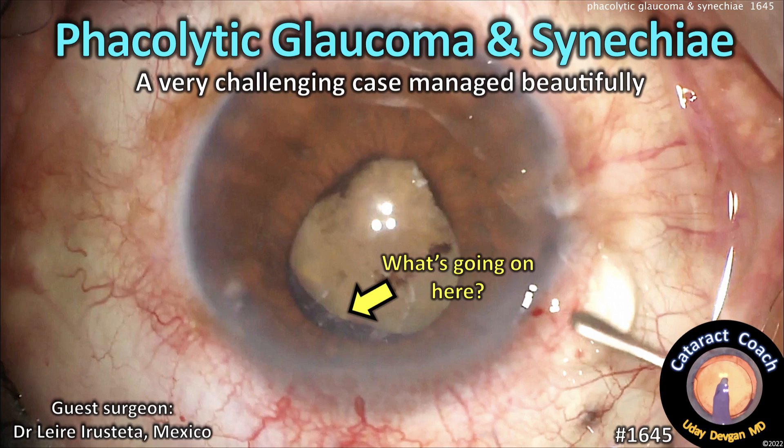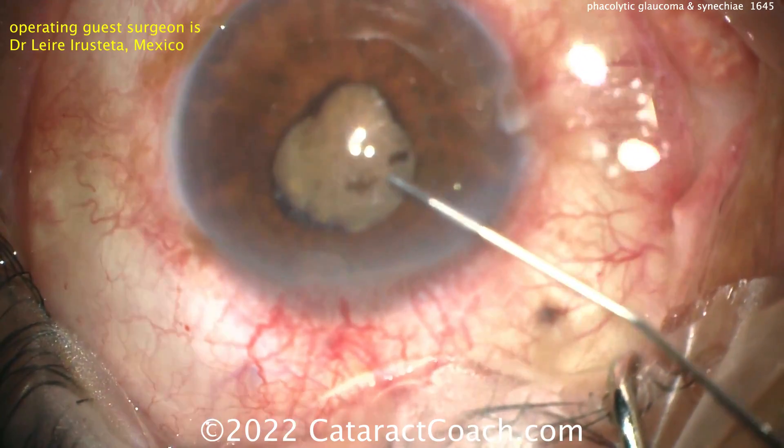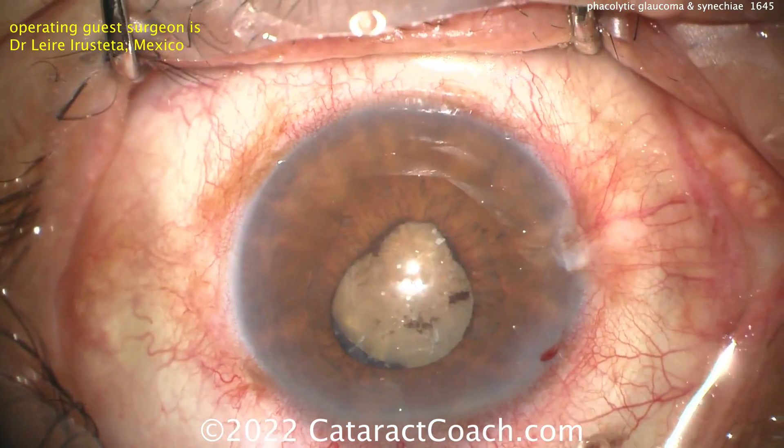CataractCoach.com presents Facolytic Glaucoma and Sinechiae — a very challenging case, managed beautifully. Our guests are here showing us a case with a dense cataract and a small pupil with a lot of sinechiae.